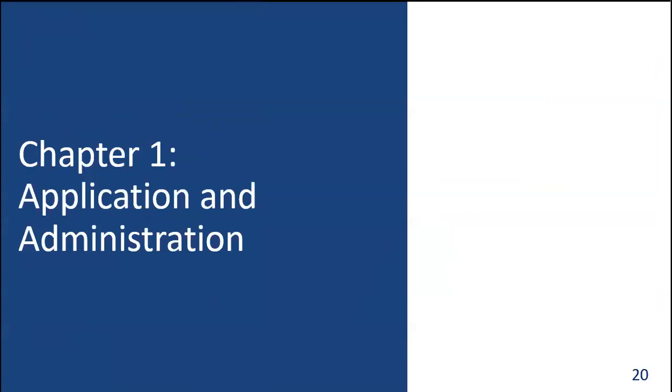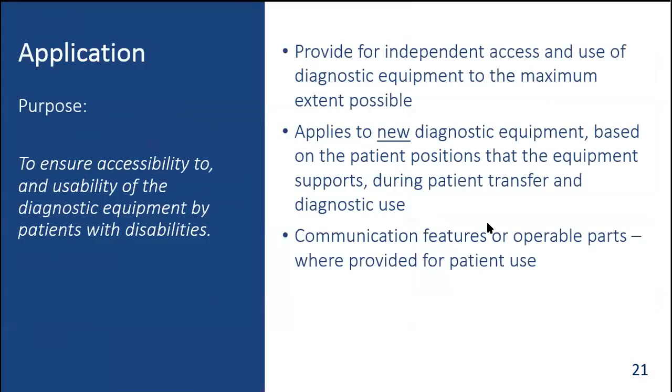Now we'll start with Chapter 1, Application and Administration. The purpose of the MDE standards is to ensure accessibility to and usability of the diagnostic equipment by patients with disabilities. The standards are designed to provide for independent access and use of diagnostic equipment to the maximum extent possible. As mentioned previously, the standards apply only to new diagnostic equipment and are based on the patient positions that the equipment supports during patient transfer and diagnostic use.